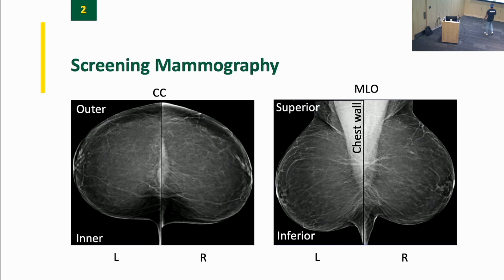The way that the radiologist interprets them is one of the big things that we look for in radiology in general: symmetry. If something is asymmetric, that's generally a bad sign. Same thing happens in breast. So rather than putting the left CC and the left MLO next to each other, we put the left CC mirrored next to the right CC, and the left MLO mirrored next to the right MLO, so that the radiologist can more easily discover the asymmetries. Okay, so 4 screening views.